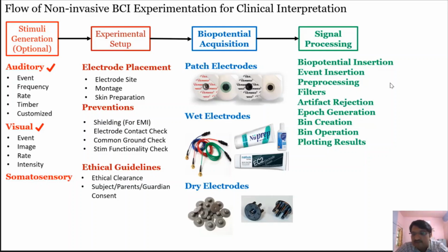Once you pre-process it and remove as much noise as you can, you have to do filtering. In most EEG analysis, we don't want any component above 70 hertz. In some experiments, people use 1 to 30 hertz or 0.5 to 30 hertz. These are the basic ranges for any brainwave or EEG processing. So then you can filter it.